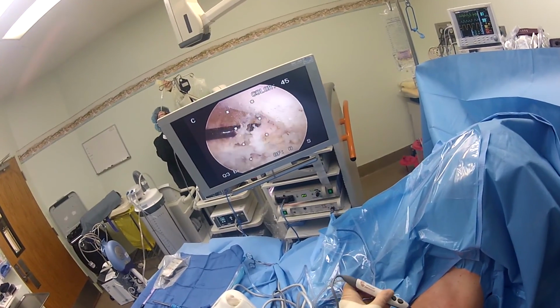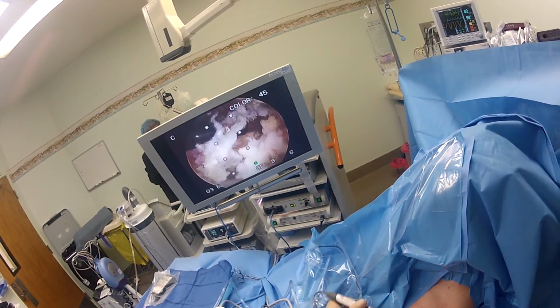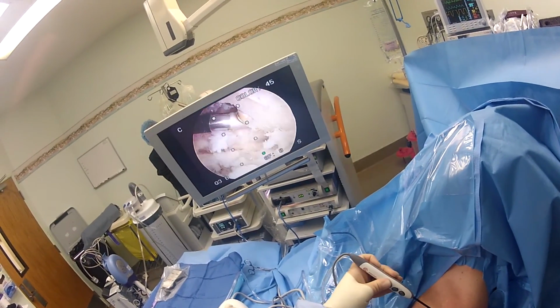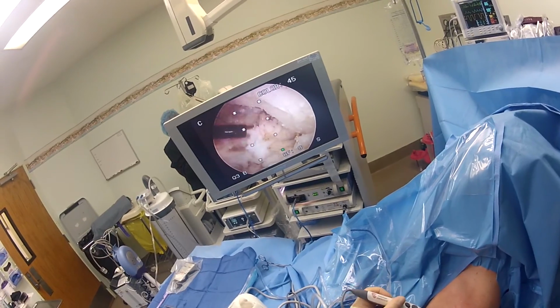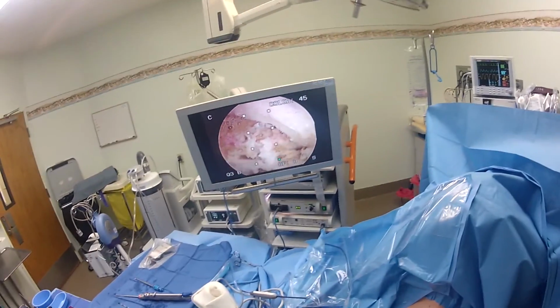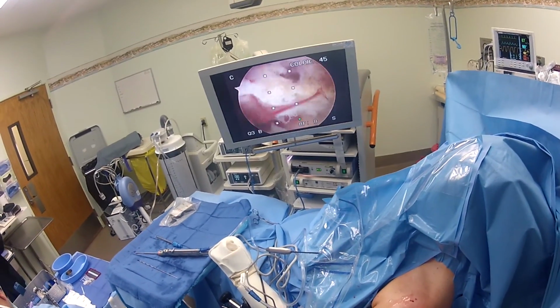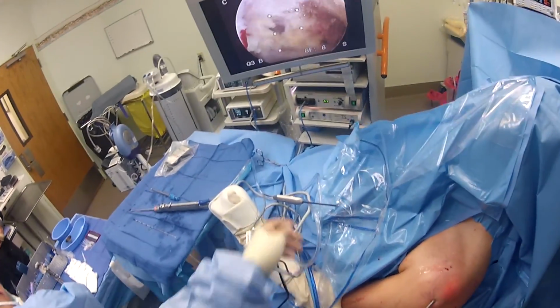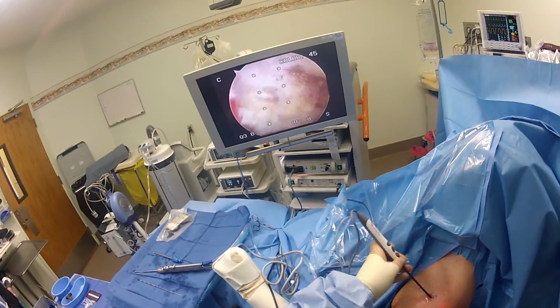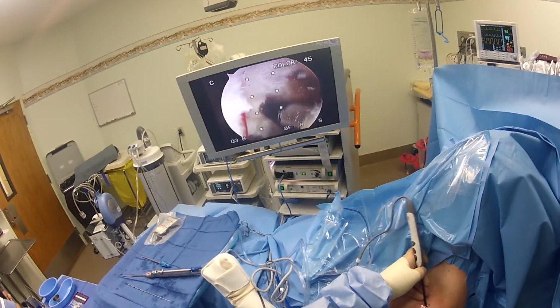So I clean out everything as best you can. You want to make sure you go back posterior, see how you can smooth out a little bit. So Dr. Bacon's saying that he's telling us he knows this is painful because the guy's heart rate went way up once we started hitting this spot, so that's always a good sign too.